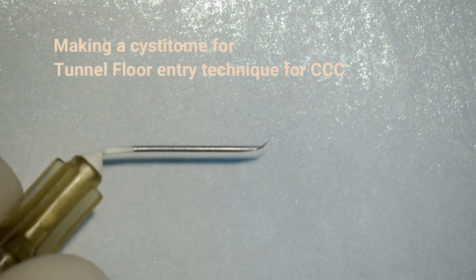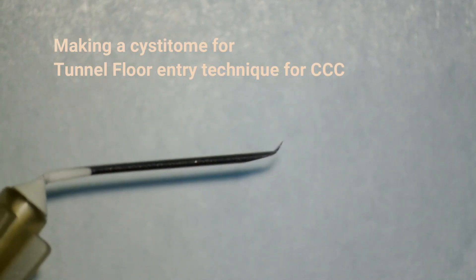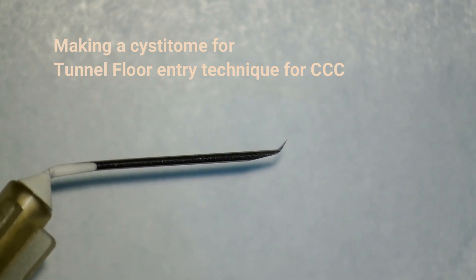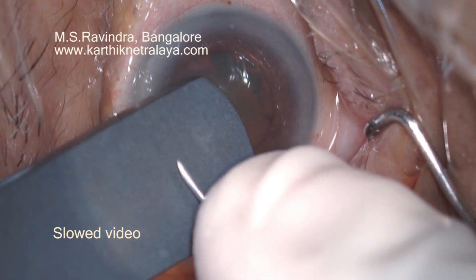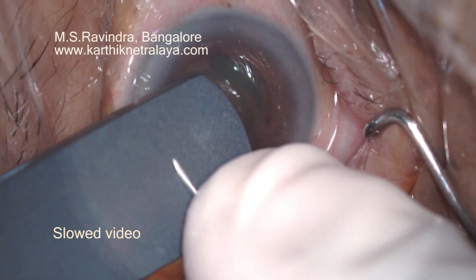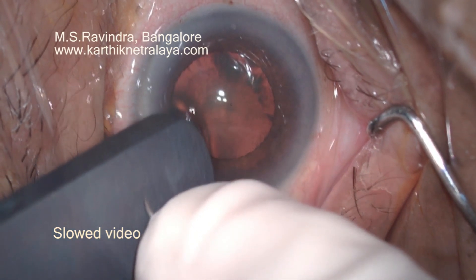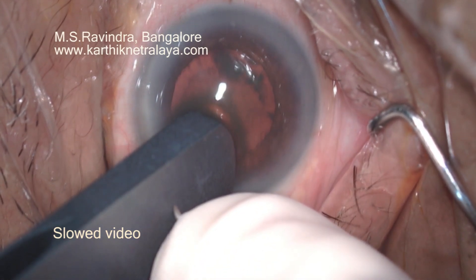That is how it should look like under the microscope. It's best created under magnification. One more good and easy way of making a very sharp cystitome is by keeping the bevel against a hard surface like the base of a forceps, keeping it flat on it and applying pressure so that the tip is bent to 45 degrees.